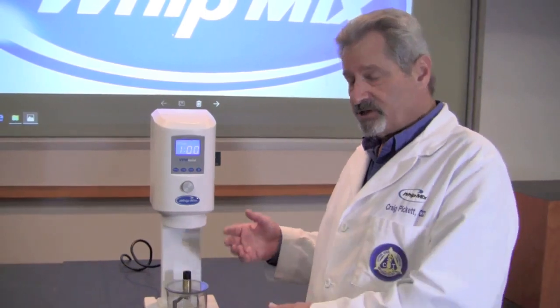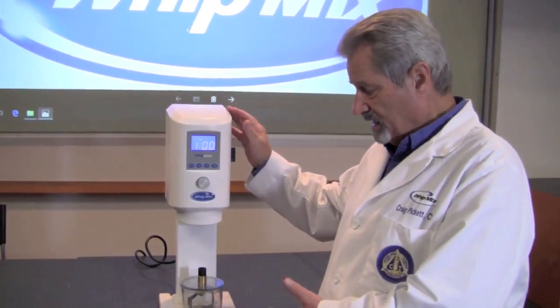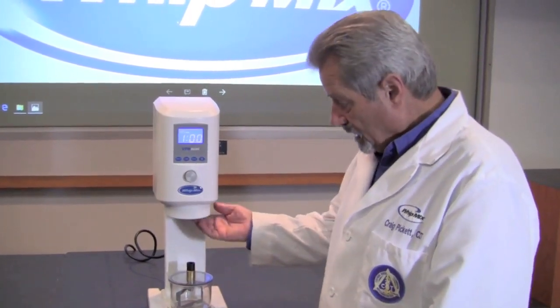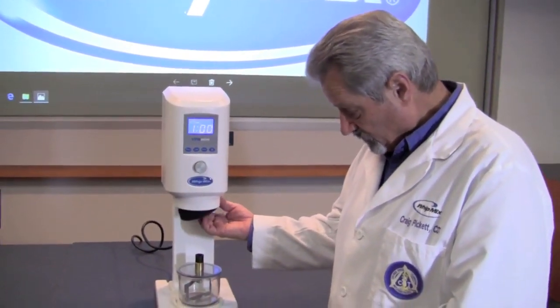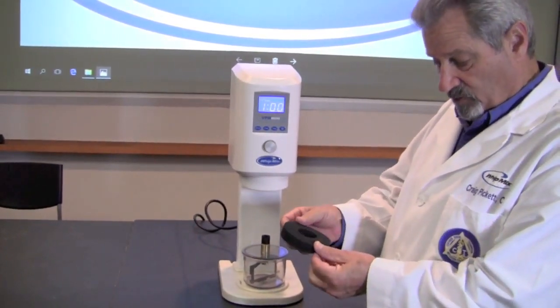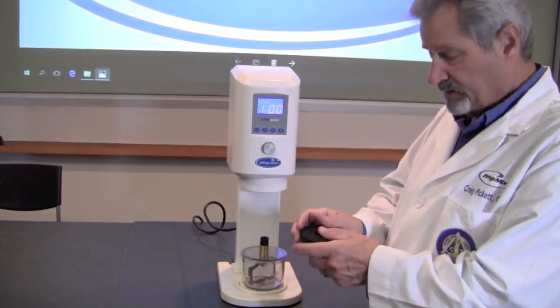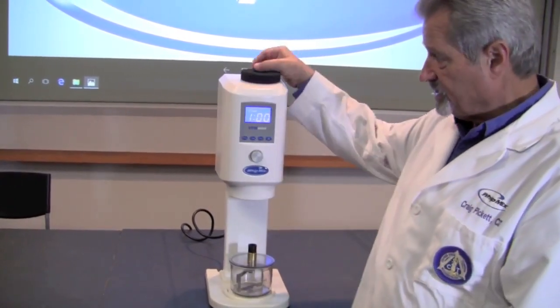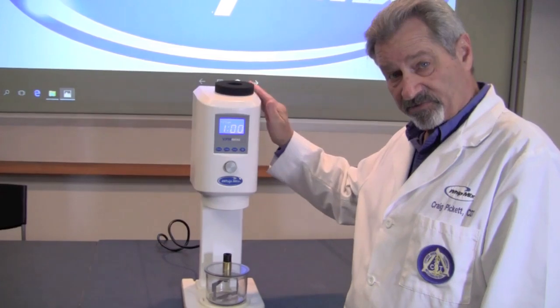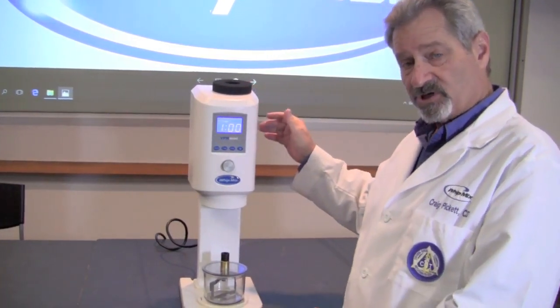One of the things we need to do with the VPM Mini is a little bit of maintenance, and you should do this every week. There is a foam filter right here in the throat of the machine. You want to remove that filter every week, wash it out, and then just set it on top of the machine and let it dry. Probably the best time to do that is on a Friday, when you're going to be leaving the machine alone for the weekend.